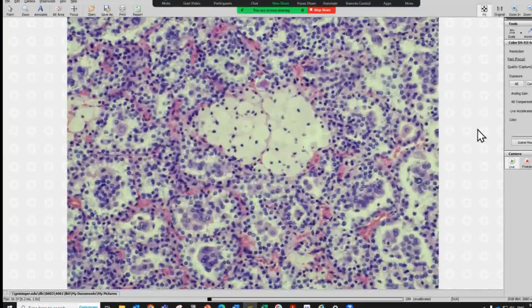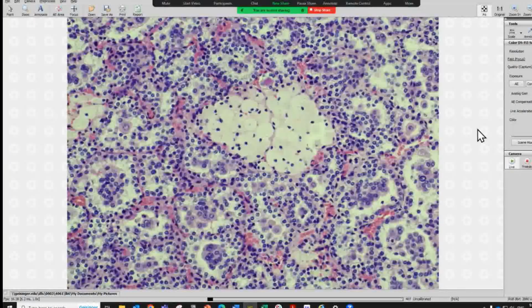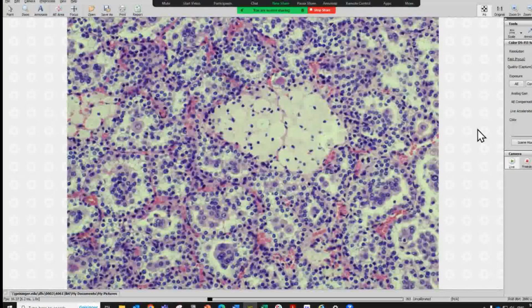Yes, for me, macrophages. Yeah, papillary RCC. That's absolutely right. So when you see papillary structure and go to low power screening of the slide on the microscope, if you bear in mind that you want to find these foamy histiocytes or macrophages, you will see them even at 2x. And then you just think, oh, this is papillary RCC, because this is really a characteristic feature of this entity. So anytime you see papillary structure, try to find this stroma, and then you will know the diagnosis.